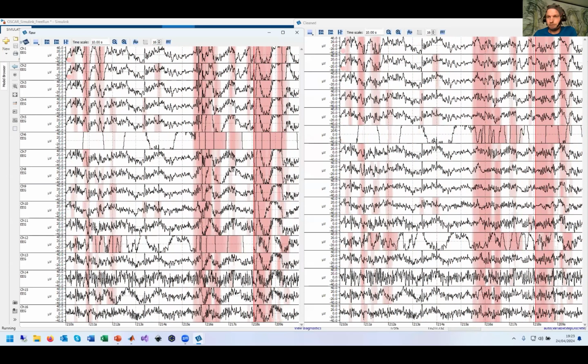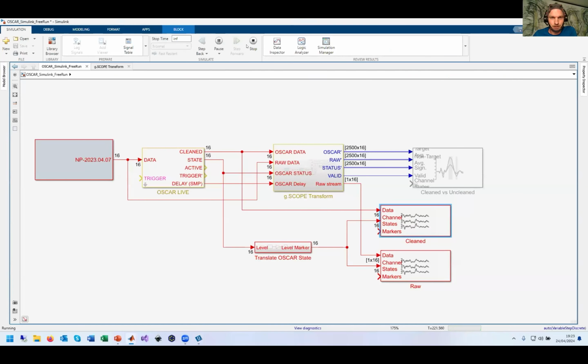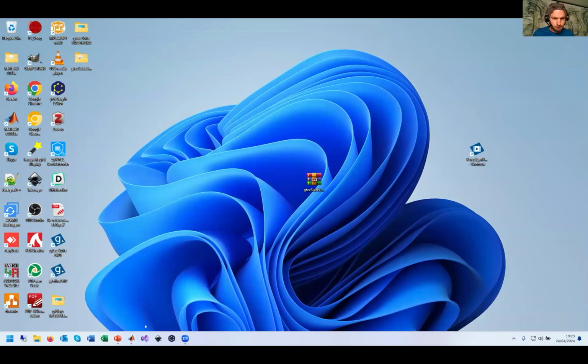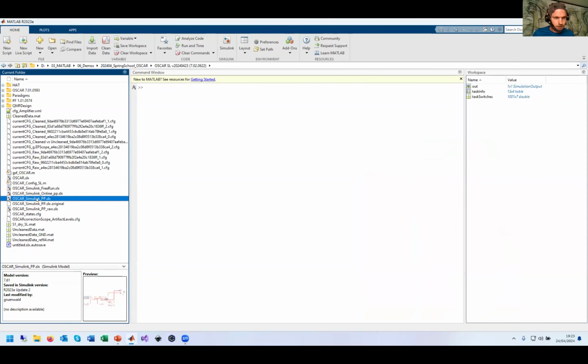Yeah, so before I lose myself here, I will stop that demo and do something that makes a bit more sense. Because I have also prepared a visually evoked potentials paradigm that I will start now.